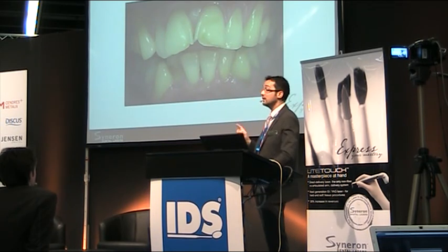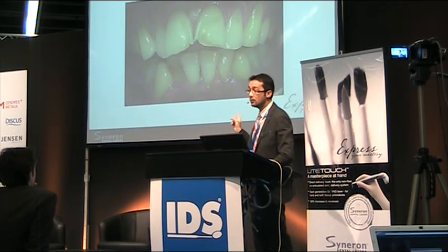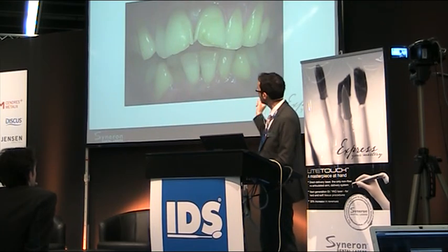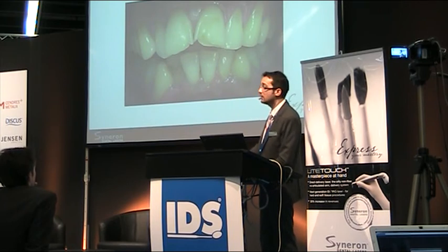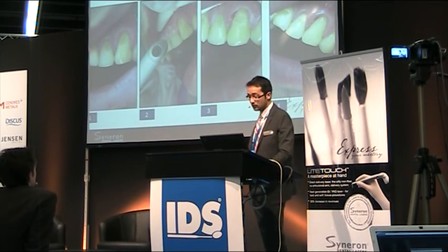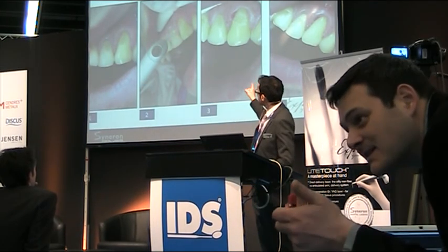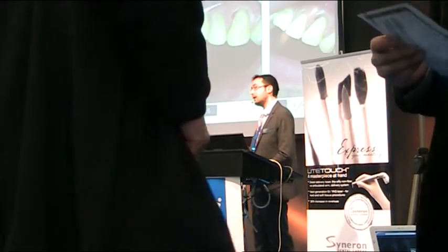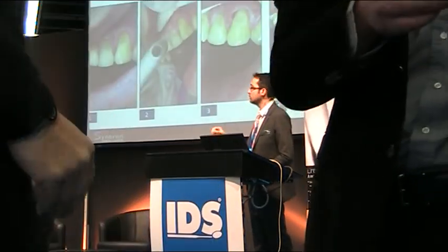Non-carious lesions of hard dental tissue. It was a young vegetarian patient that consumed a lot of fruits, a lot of juices and so on, and this is a very severe erosion, a very unpleasant and painful clinical situation. All the teeth were treated, and you can see on picture number 3 that the gum is affected. This is my error, because when I began to treat with laser, I had to adapt my mobility and concentration. It's pretty different from the bur, from the rotating instrument.